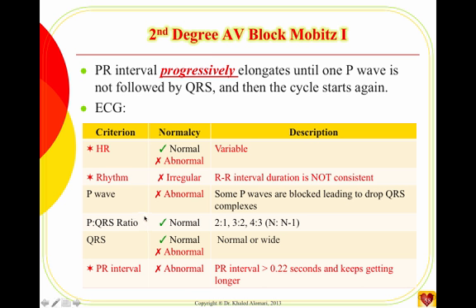And the other thing is there's always 1 P in each cycle, only 1 P that's being blocked. Okay, so let's see here in this gate. When this gate opens in 2:1, the gate opens and closes, lets only 1 car leave and holds the other car. So only 1 P moved and caused 1 QRS.